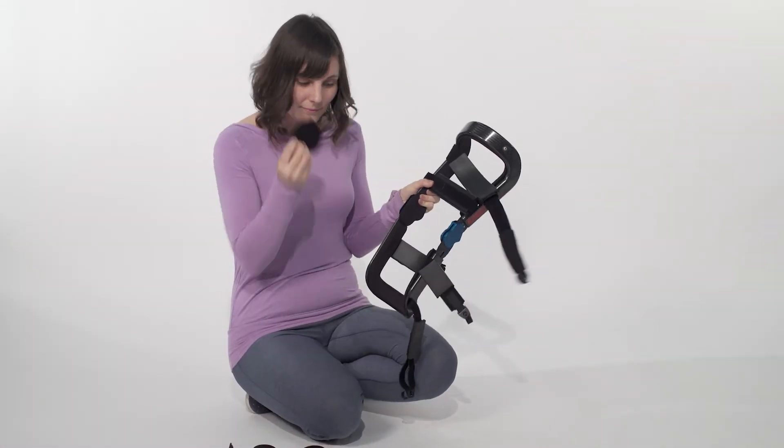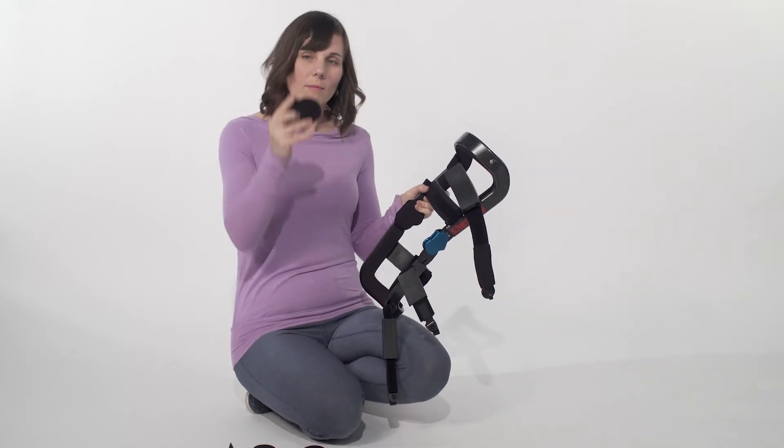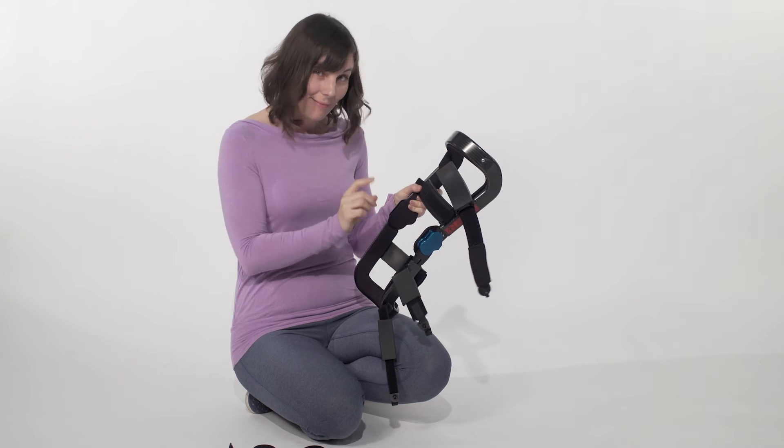The condyle pads are found on the inside of your brace. Tug at the edges to release the velcro and choose which thickness you'd like, and press the new pad into place.